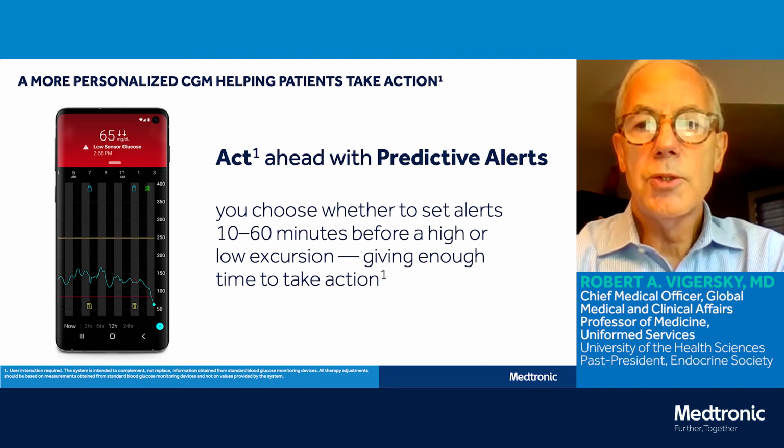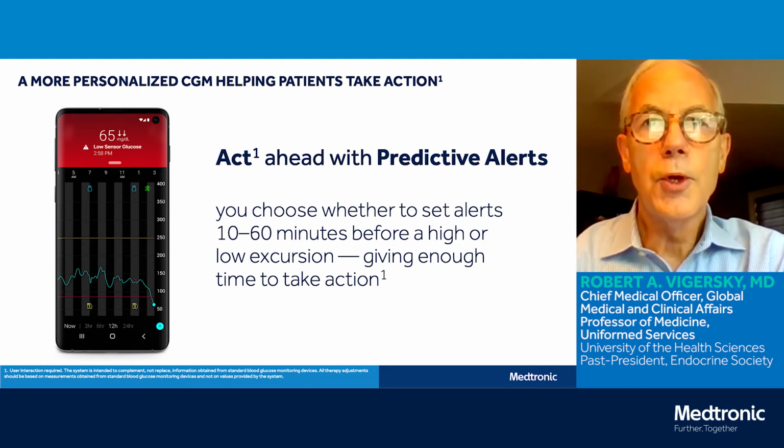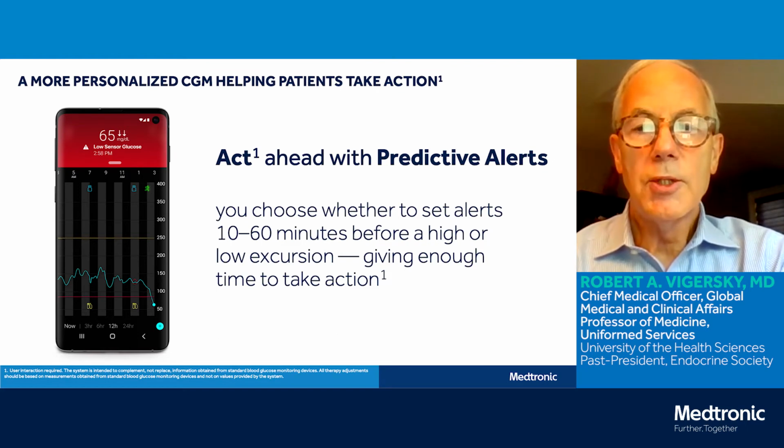The system is intended to complement but not replace blood glucose information. So all therapy still needs to be based on measurements obtained by standard fingerstick measurements.